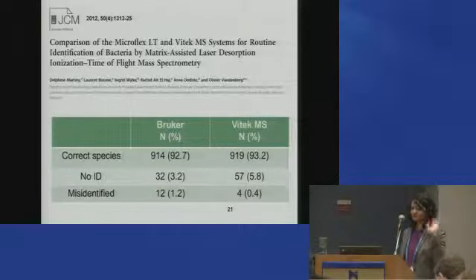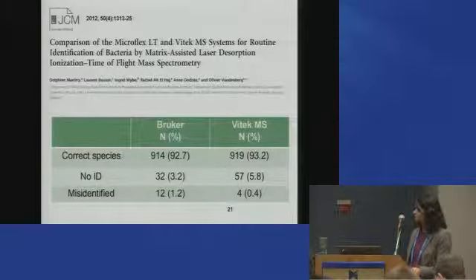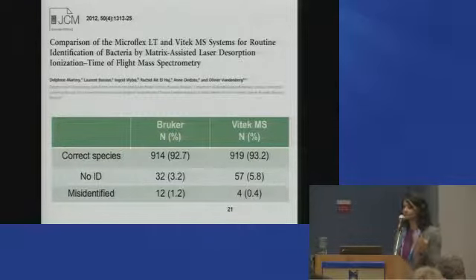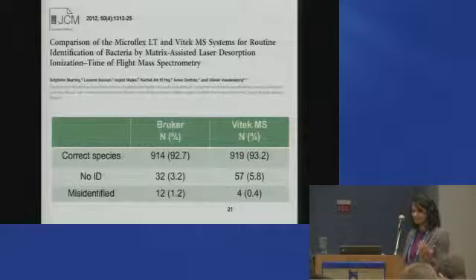It's just that you shouldn't put everything away, that you're never going to utilize some of these other reagents till you are sure that your organisms are panning out well. And then, of course, sometimes in the databases, some organisms may be misidentified, so that's just something else to keep a very open mind about: don't believe everything you see. Make sure that when you have a match with your organism in the database, you're looking at the organism, looking at the match, and you're looking at some ancillary tests before you really believe what you see.